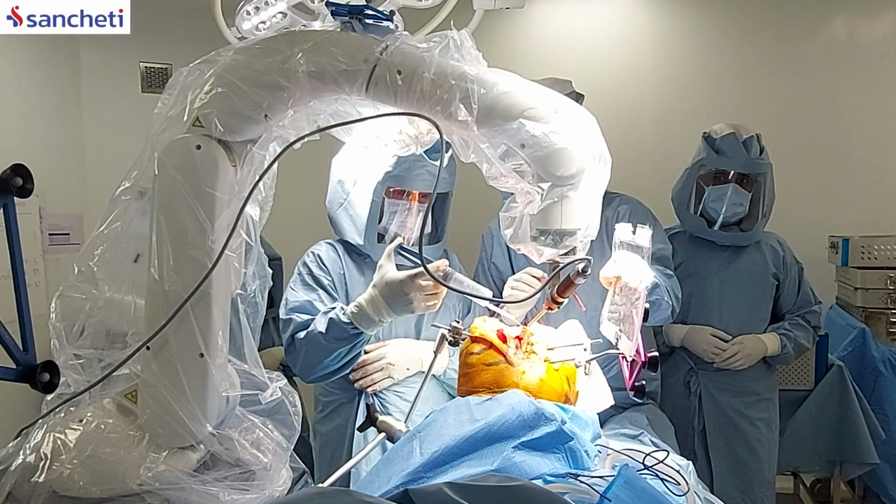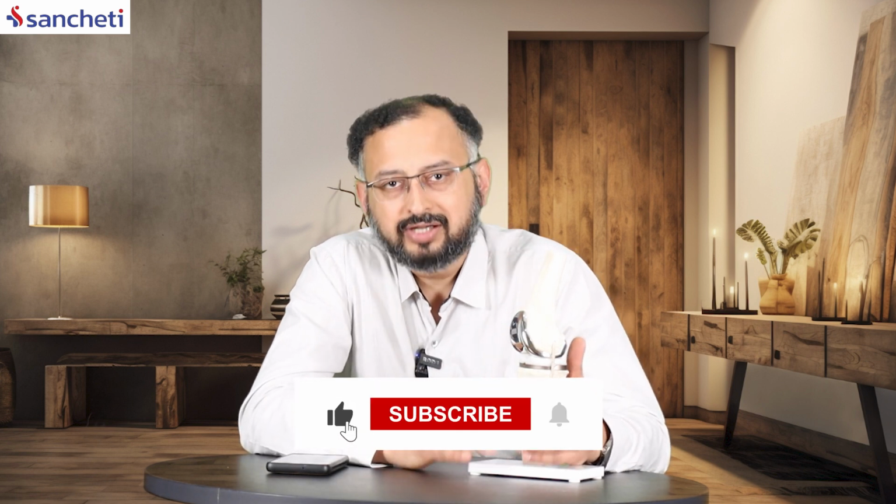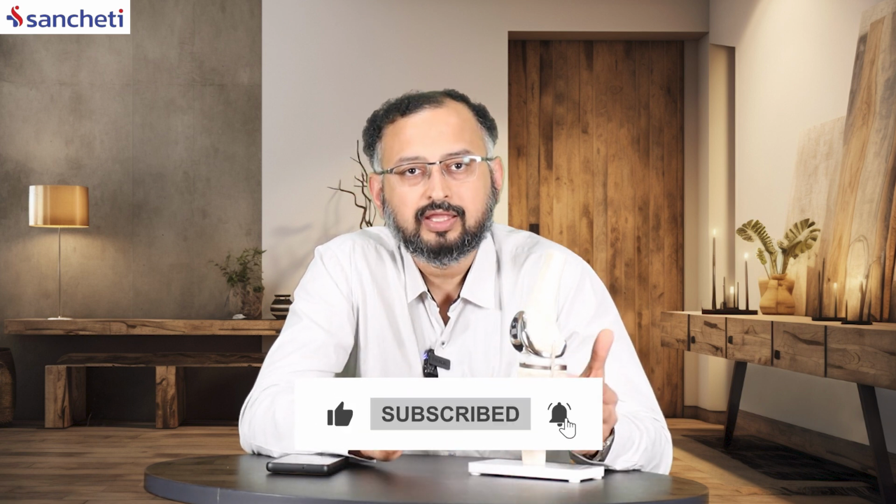The robot is going to come and make each and every cut very precisely. It is done under total supervision of the surgeon. The surgeon is there. Wherever he feels that there is something he's not happy with, he can stop the robot, and we can restart the entire process. Once this is all done, we wash the joint thoroughly, remove the small debris, and then fix the implant with the help of bone cement. Then the standard closure of the knee joint is done, and the patient is rolled to the recovery room.